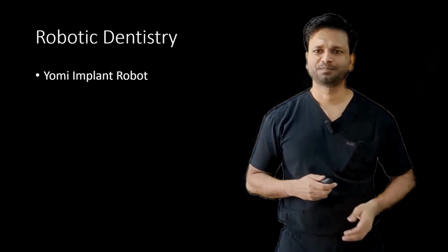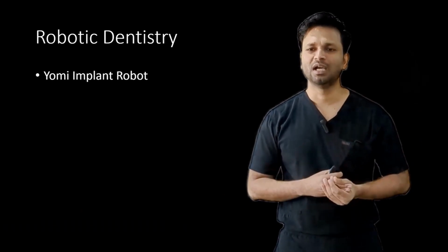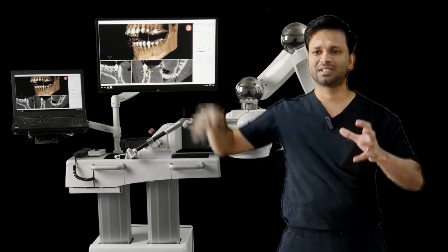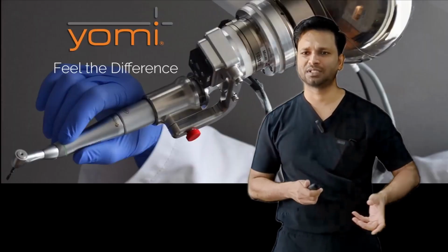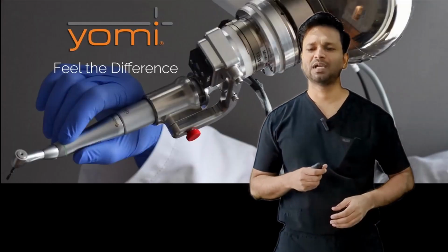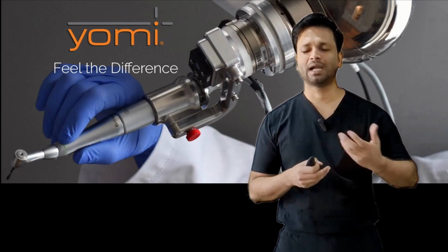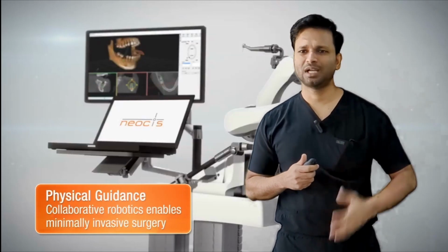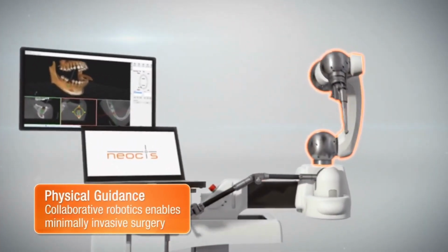So that was that. One last thing is robotic dentistry. This is an implant robot, and you can see there are these round balls. This is an arm of the robot, and at the end of the arm they have the handpiece. You can see the end of the robot's arm has an implant handpiece. So let's see the video. I'll explain everything in the video. So this is the arm of the robot.